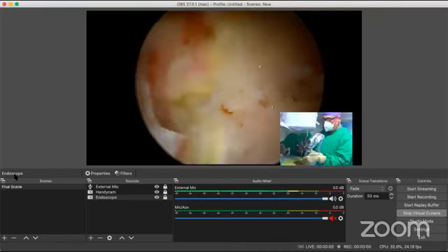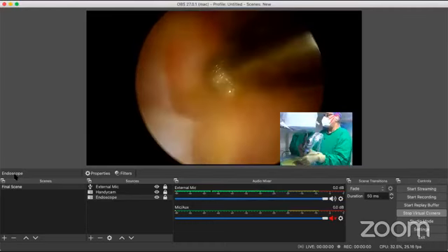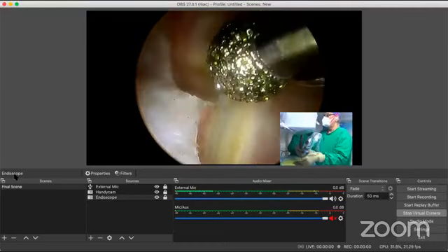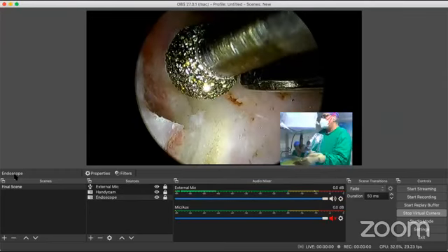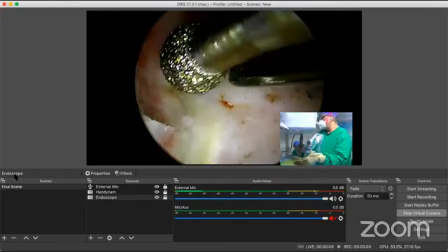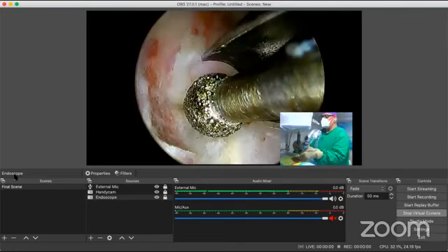Okay. Boom. Machine back, please. Back machine, please. Table up. Up. Back machine, please. Thank you.